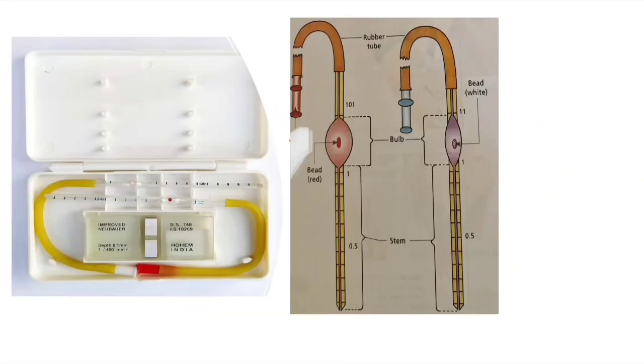Now we are going to discuss in detail the hemocytometer box. This box we can see here is a hemocytometer box.